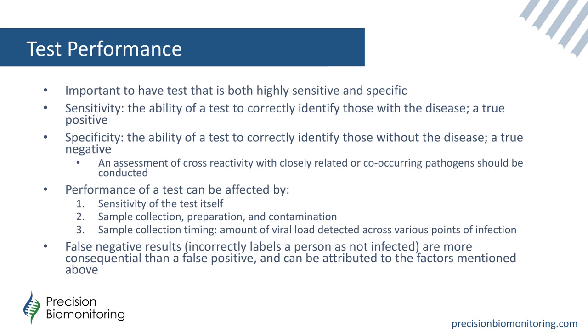So if it's a nasal sample, that would be other respiratory organisms. For tests that are working on a saliva-based collection, if that's something that your PCR test is designed to work with, that list of cross-reactivity organisms would be different because you're wanting to test against other things you might find in your mouth instead of your nose. And luckily, the list is not overlapping entirely.